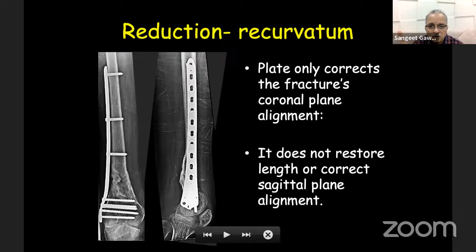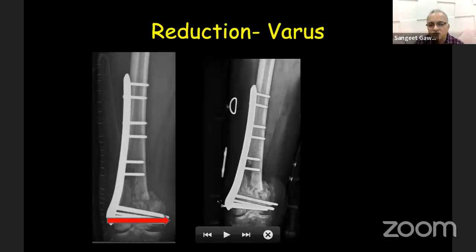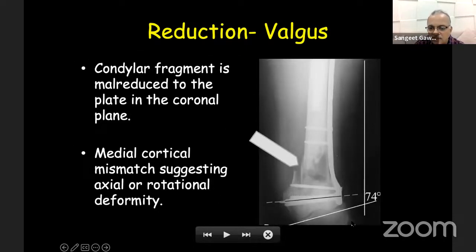A plate only corrects the fracture in the coronal plane. It does not restore the length or the correct sagittal plane alignment. Varus deformity occurs because your last screw is not parallel to the tibial condyle. If you are aiming the screw obliquely, you end up in a varus, which is the worst complication, and the patient will have a painful limb, which is not acceptable. The second commonest deformity is a valgus deformity, which usually happens when your screw again is not parallel and the rotation of the distal fragment has not been addressed.